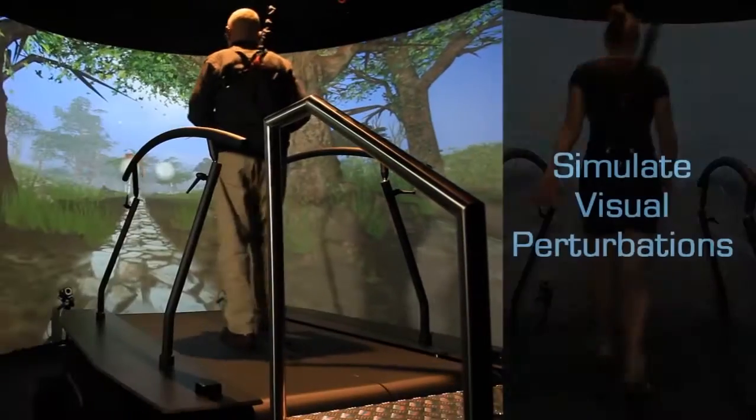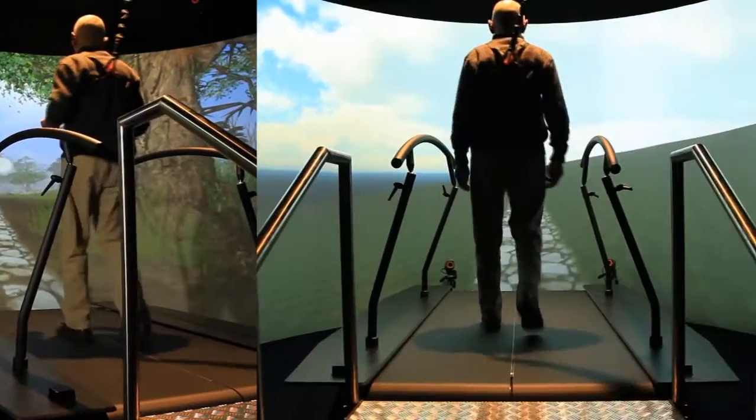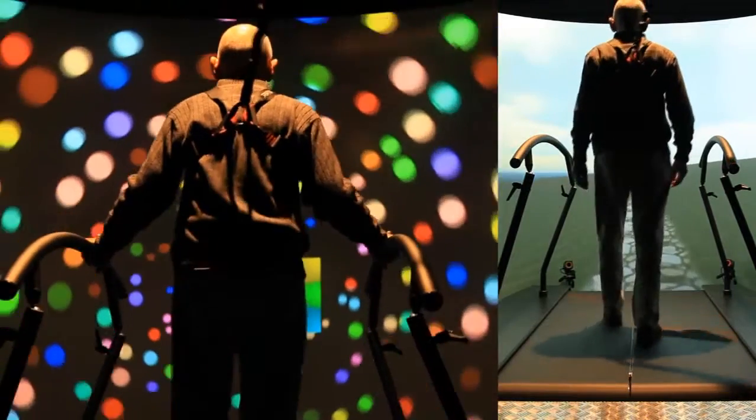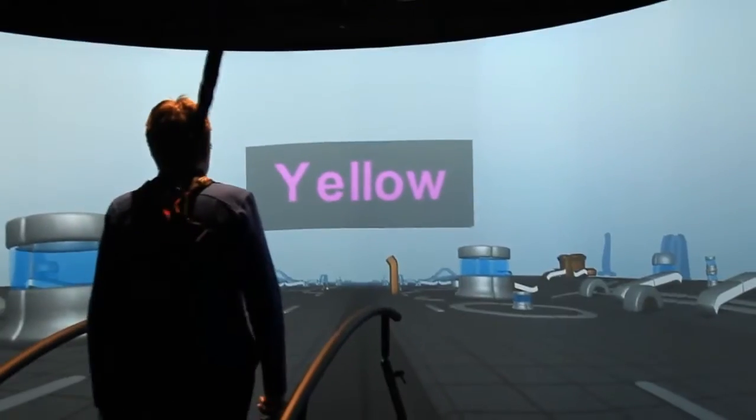Visual perturbations like changes in visual flow are possible, as well as cognitive dual tasks, like for example the Stroop test.